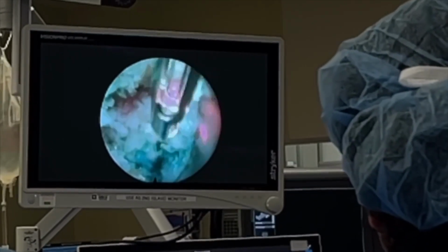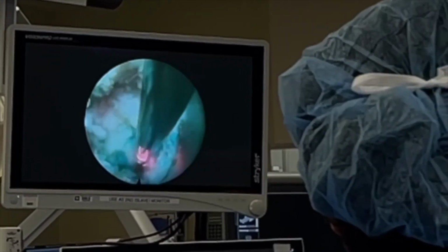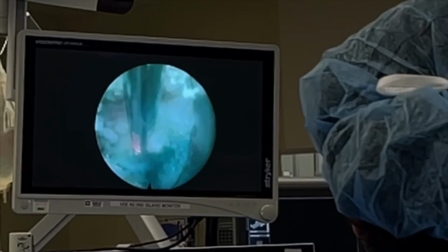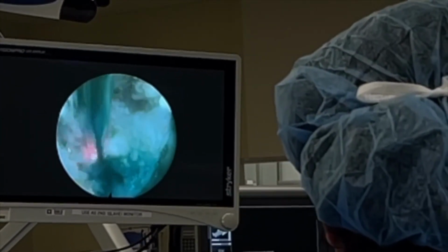So people that don't have this, they use mechanical instruments like the spinning drill or reamers or curettes. And I'm sorry, this is way sexier. Way more fun. And I can stick my pinky out.